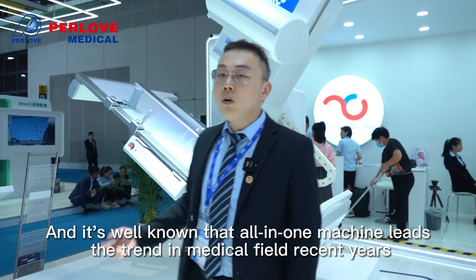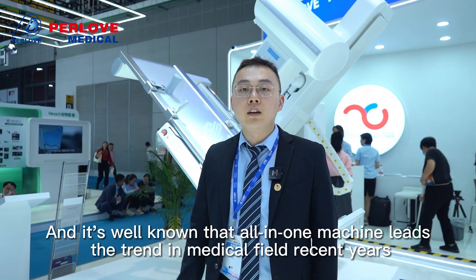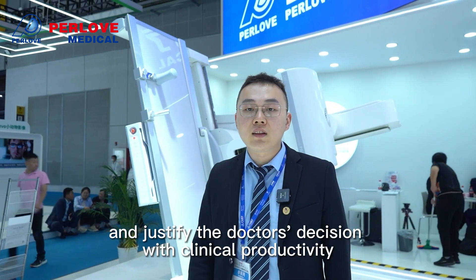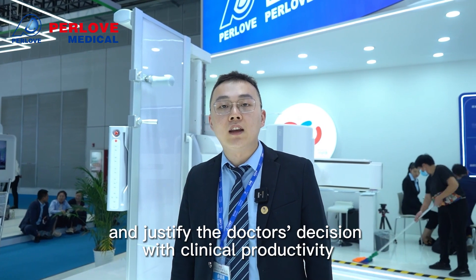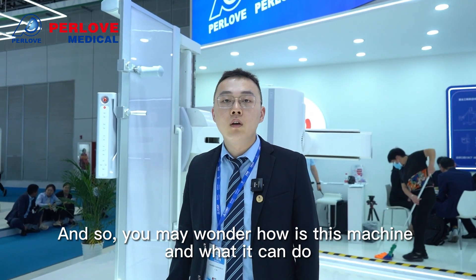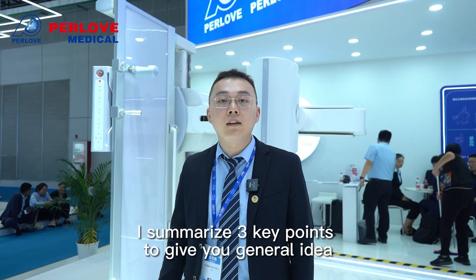It's well known that the all-in-one machine leads the trend in the medical field in recent years. This machine can be the workhorse for daily examination and support the doctor's decision with clinical productivity. You may wonder what this machine can do, so I've summarized three key points to give you a general idea.